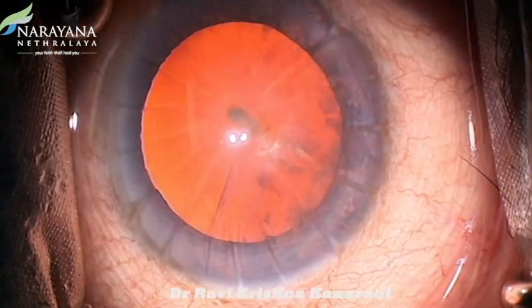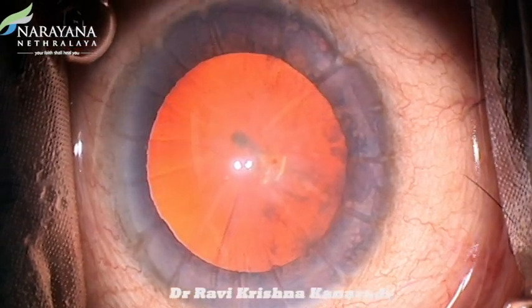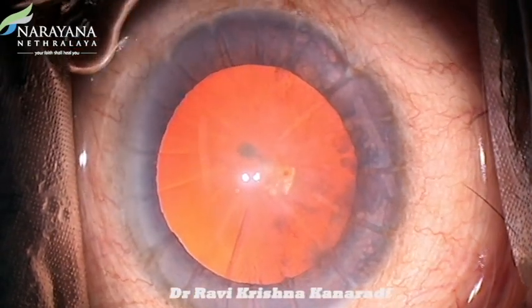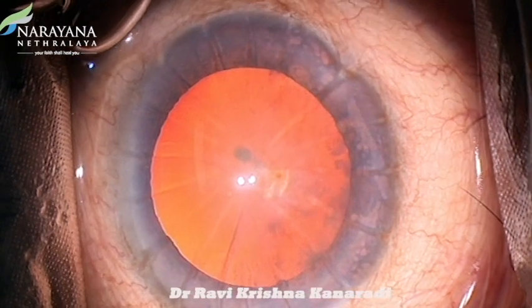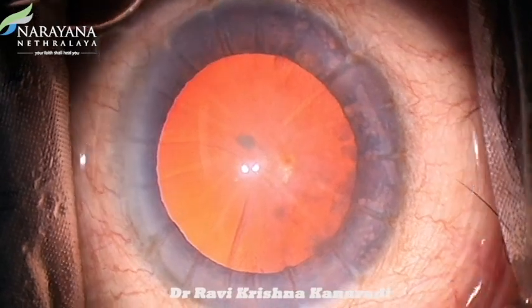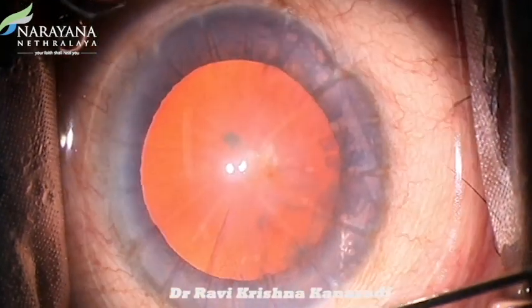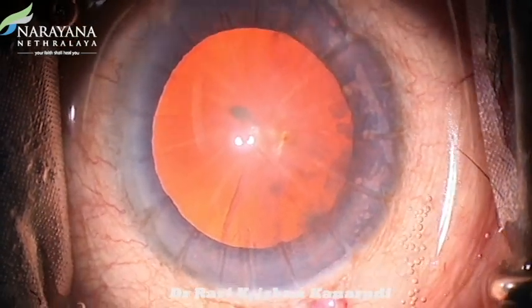Scleral tunnel incisions are typically preferred for wound construction when we have more than 8 cuts. A clear corneal incision can be made between the RK cuts. However, incisions close to the RK or too central are at a higher risk of enhancing the irregular astigmatism and affecting the structural integrity if they cross the RK cut.